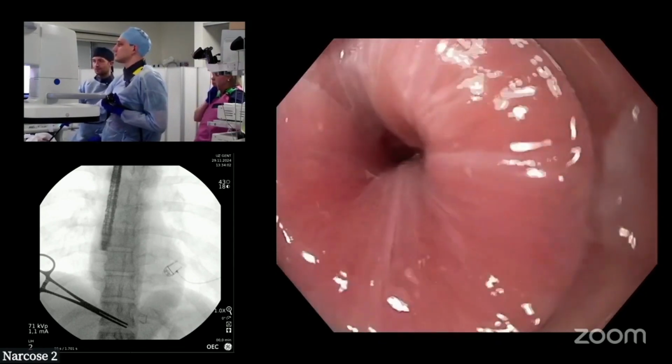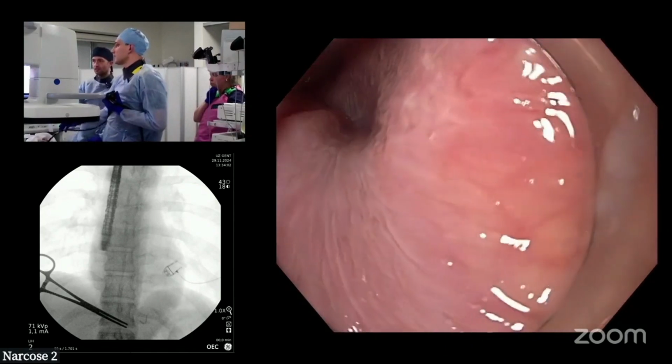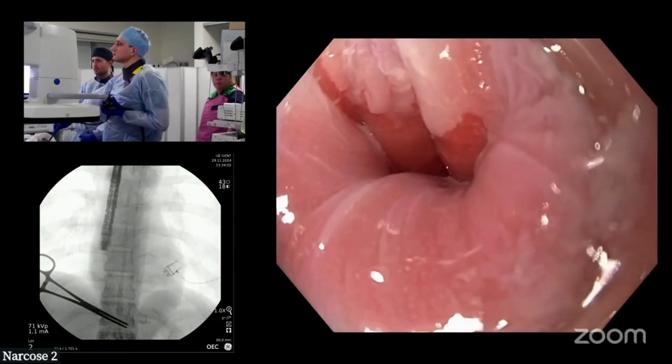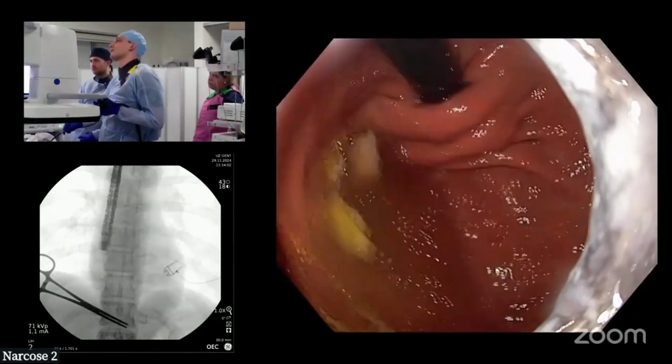Normally, you see the columnar epithelium straight away when you put a gastroscope down. Here, you don't see it. So it's clearly too tight. Yeah. And actually, the behavior of this looks like the wrap is too tight rather than anything else, just looking at it. Let's do retroflexion.